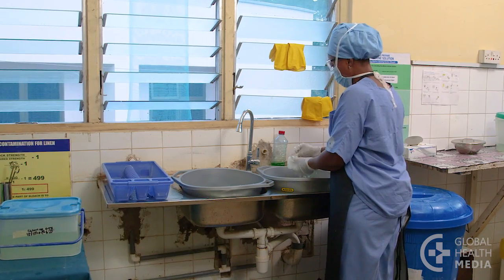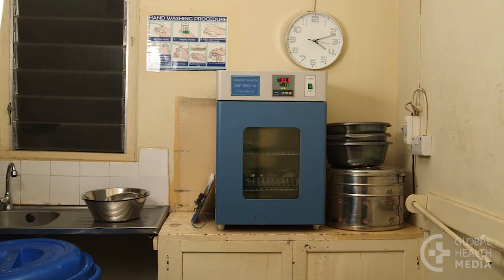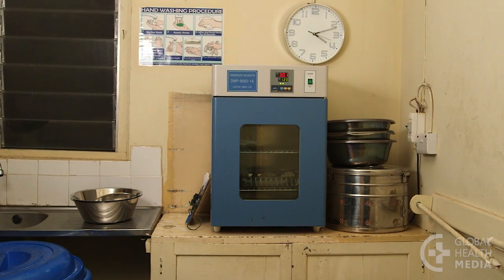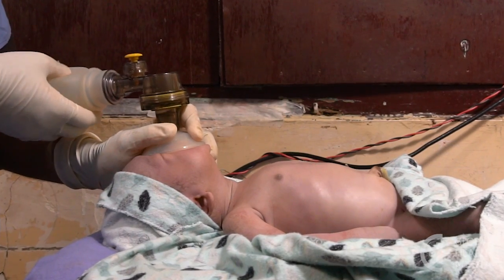This video will show the key steps of cleaning resuscitation equipment, including sterilizing the parts in an autoclave. This will make the equipment safe for the next baby.